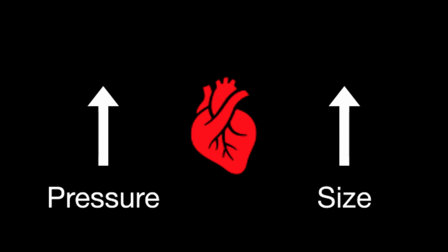So with that said, we know, okay, we put a thrombus in there, we get an increased pulmonary vascular resistance. We have an increased pressure that's seen in the right heart. The right heart's going to respond to that acute increase in pressure by increasing its size, because it can't increase its hypertrophy just in the acute phase.